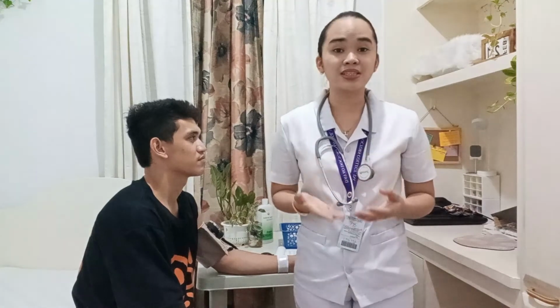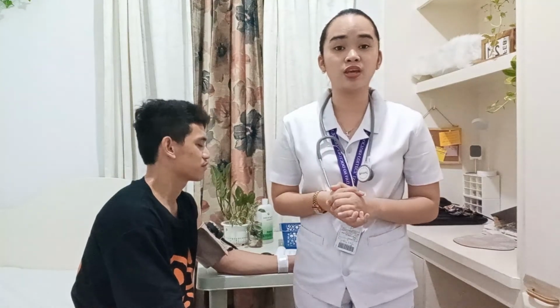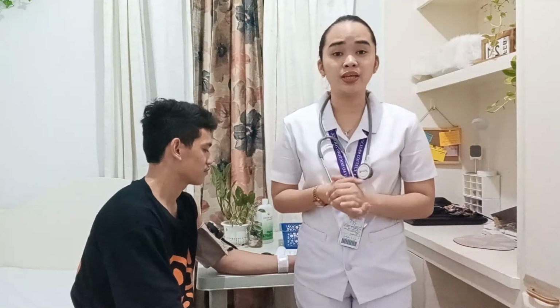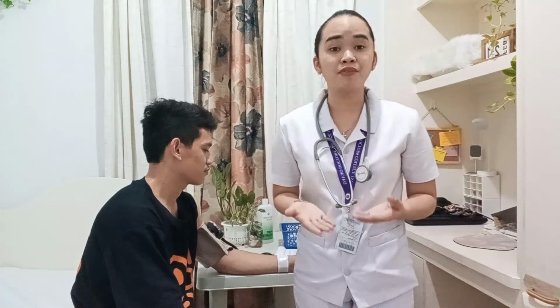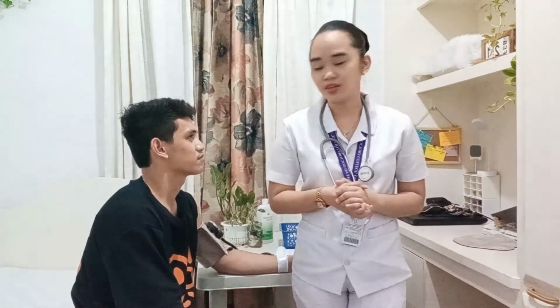Now that I have fully deflated the cuff, the first sound that I have heard would be his systolic pressure, which is the Korotkoff phase 1, and the muffled sound with soft blowing quality would be his first diastolic pressure, which is Korotkoff phase 4, and the second diastolic pressure or Korotkoff phase 5 would be the level of silence after the last sound that I have heard. Okay?